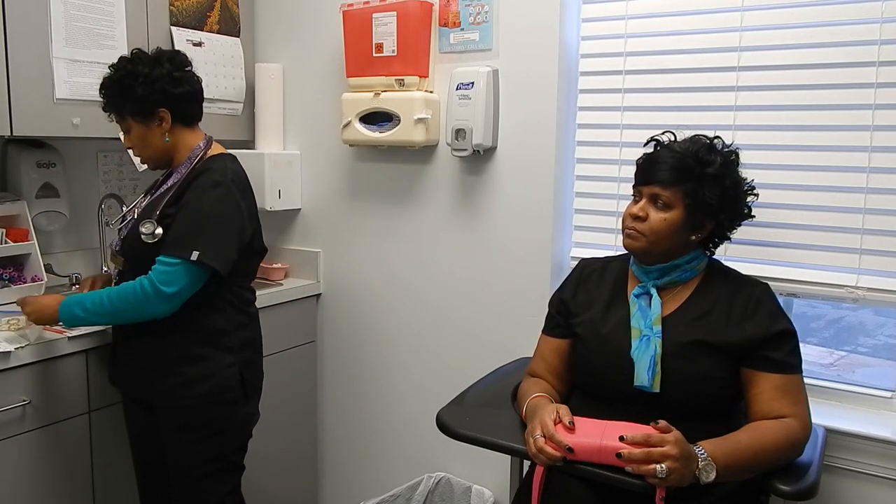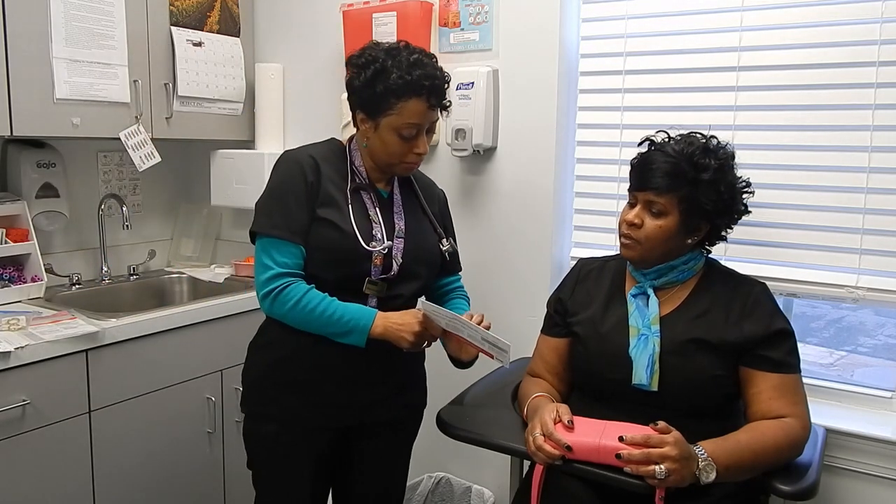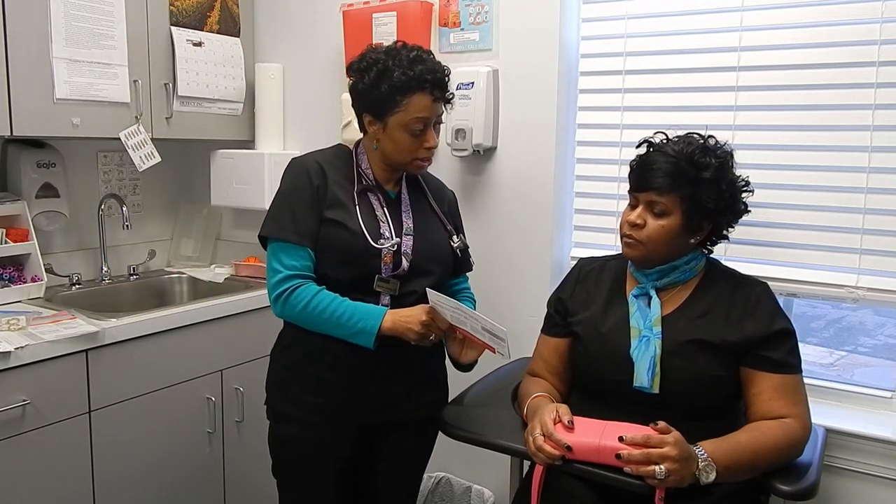Before we get started, I want you to see — I need to take a sample of hair. I want you to see a picture of it; it's about that much. I'm going to use the back lower section over here and I'm going to try to be as discreet as possible.